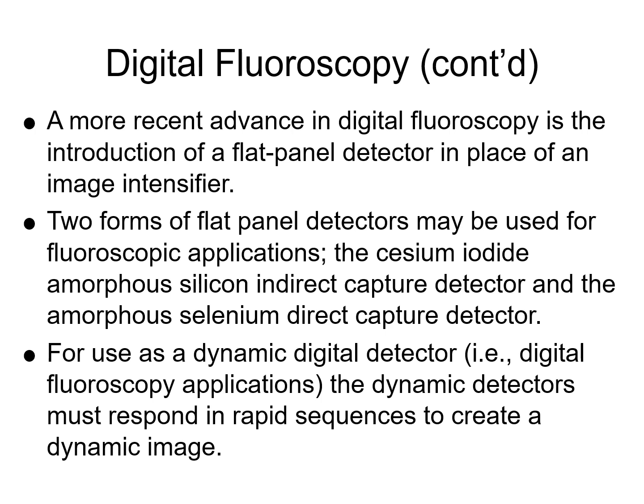In a dynamic fluoro array, it's the same technology. We're just finding faster ways to read out the pixels. And so we can get an image downloaded from that image receptor and processed and displayed in thousandths of a second rather than 2 seconds for the DR flat panel. It's just speeding up the readout electronics with the dynamic detector. Actually catching the remnant signal is the same technology for a flat panel plate like the Canon plate on the portable machine as it is for the flat panel fluoroscope.